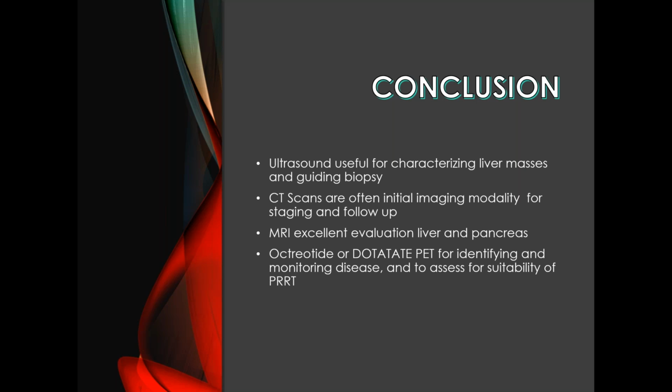CT, when you have a metastatic bone lesion, it takes some time for the metastatic bone lesion to actually destroy bone so that we can actually see it on CT or change it on the CT. Whereas you can detect things earlier with Octreotide or with MRI because they are able to pick up the receptors, or they will show the soft tissue itself before it actually starts to really destroy bone. So that's why CT picks up changes later than the other two modalities. So really, I guess it just depends on where you are. Maybe an MRI or an Octreotide / DOTA-TATE would be useful.